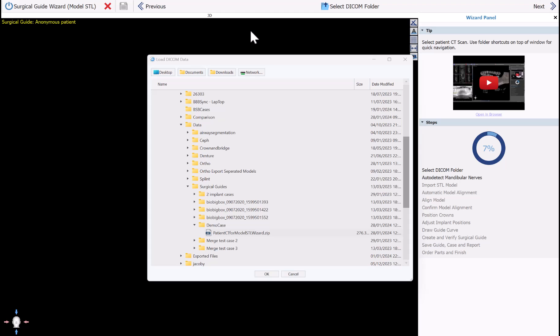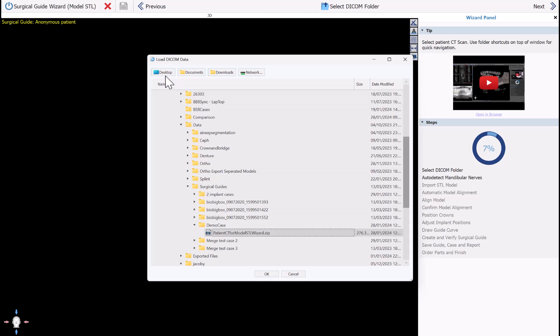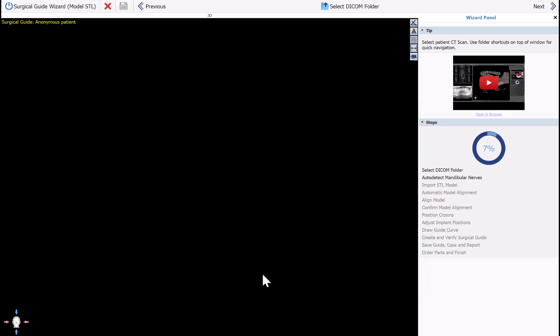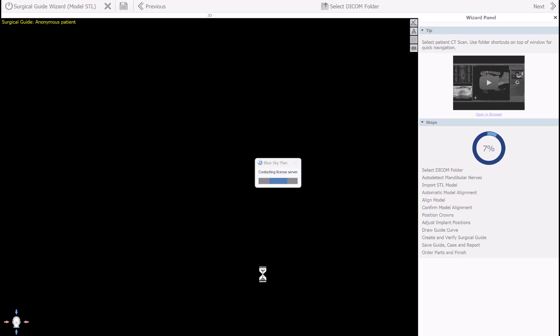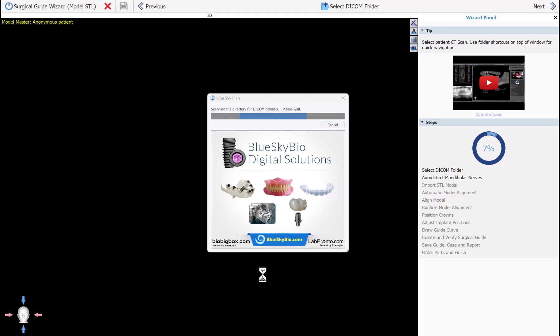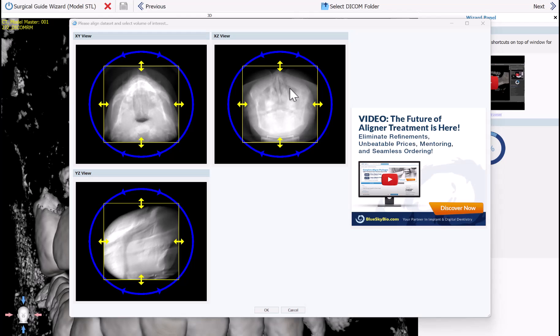The software is now prompting you to select the relevant CT scan. Navigate to the location on your computer where the CT scan is saved — you can use the quick access buttons to access commonly used folders. Select the CT scan and click OK. Blue Sky Plan will import compressed, uncompressed, zipped, or unzipped CT scans, so just select what you have and the software will load it accordingly.